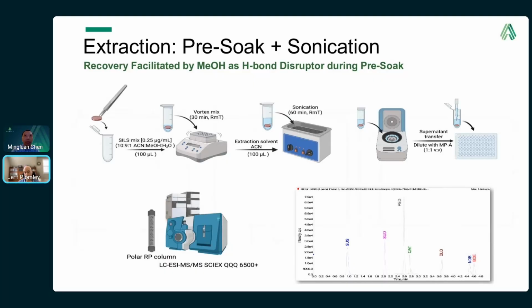dilute with mobile phase compatible conditions to run this assay under gradient conditions that allows for suitable separation of each of the drugs in the panel, which I've shown here. Fortunately, they all ionize by positive electrospray, so we did not need to do any polarity cycling. The detection limit was such that we had a reasonable extract dilution factor to mitigate any sorts of matrix effect.